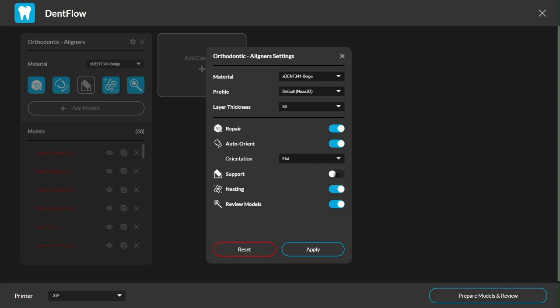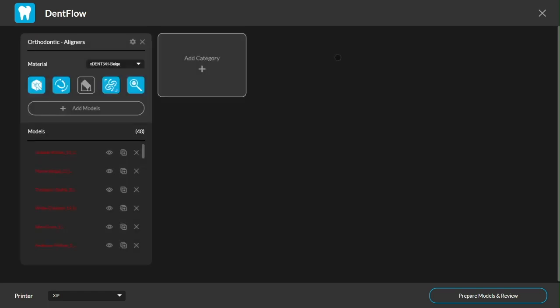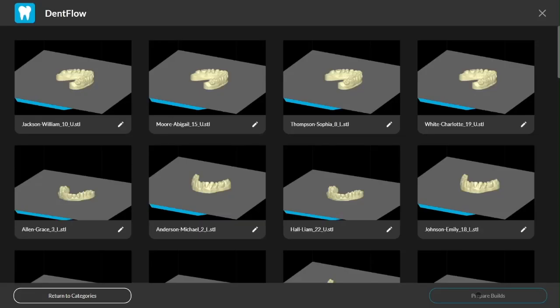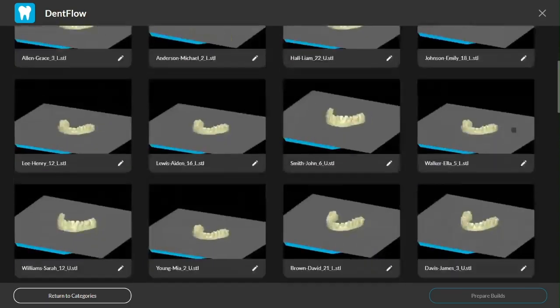Okay, now that I've chosen my settings, the software can do its magic and review the results. Hey, look at that. All 48 models, repaired and oriented flat on the build plate. What a beautiful thing.